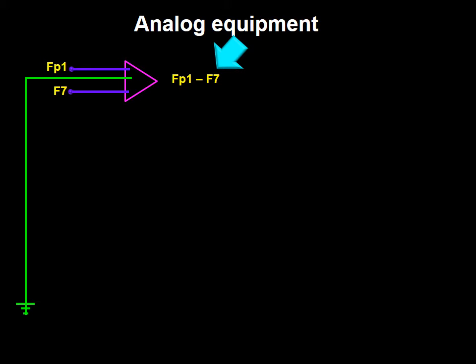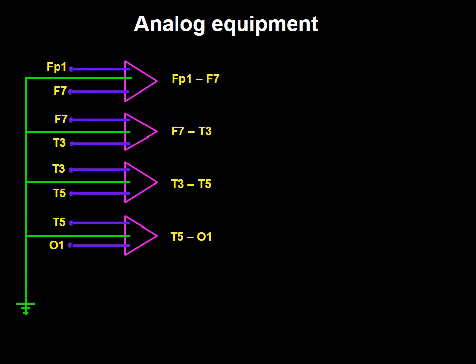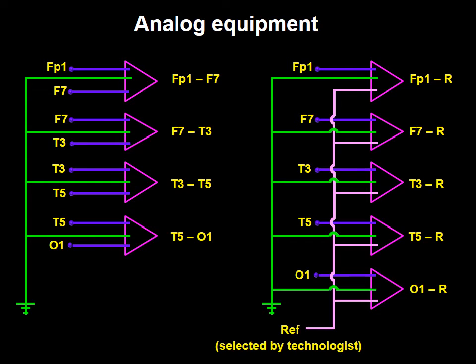In this frame I am introducing the derivation they constitute. I have done this to give me room in the following frames to introduce an array of electrodes, as I have just done, representing a bipolar montage, using the non-modified 10-20 system guidelines, and on the other side of the frame a common referential montage using similar electrodes. I will first explain the figure on your left.